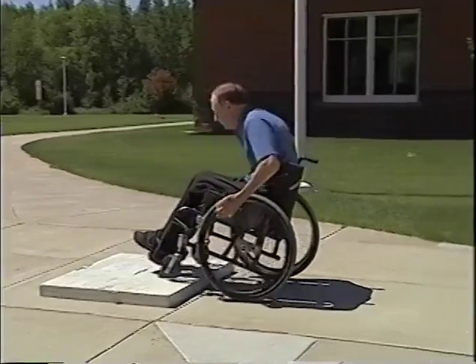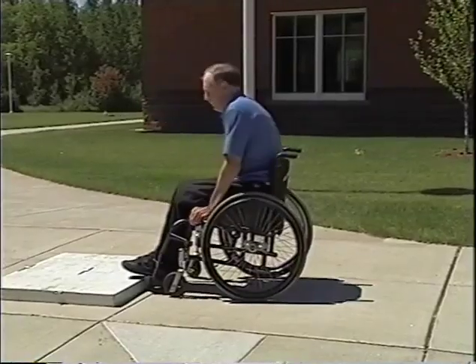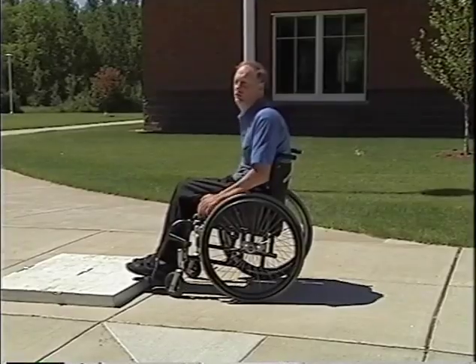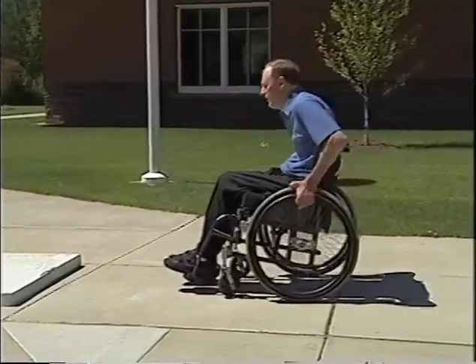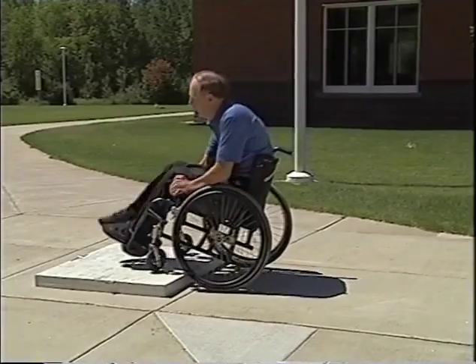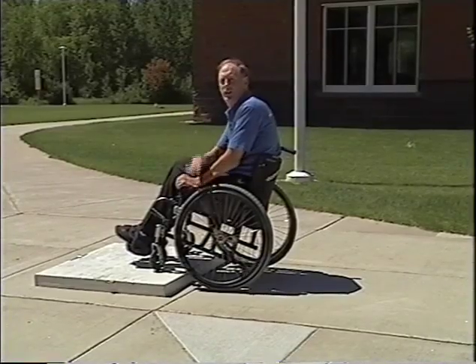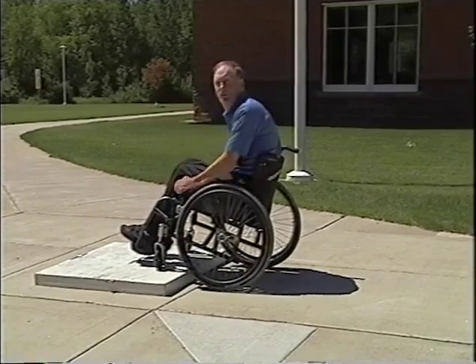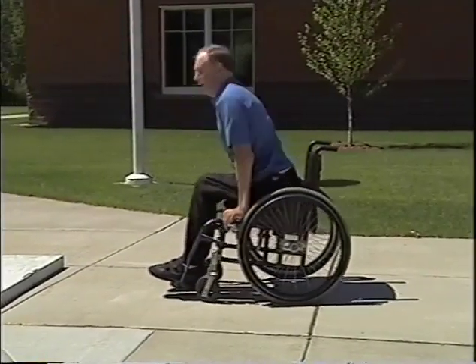Right? One thing, as a therapist, if you're trying to diagnose what's going on, one thing that's very diagnostic is if you hit the wheels, your back wheels, on the curb before your front end. Now watch my feet. You'll see that they fly forward when I do this jump. When you see the feet going forward like that, it's very diagnostic of your back wheels hitting before the front wheels are down on the curb, and that slams your front end down and your feet go flying off. So that's one little thing to remember if you're watching, trying to figure out what's going on.